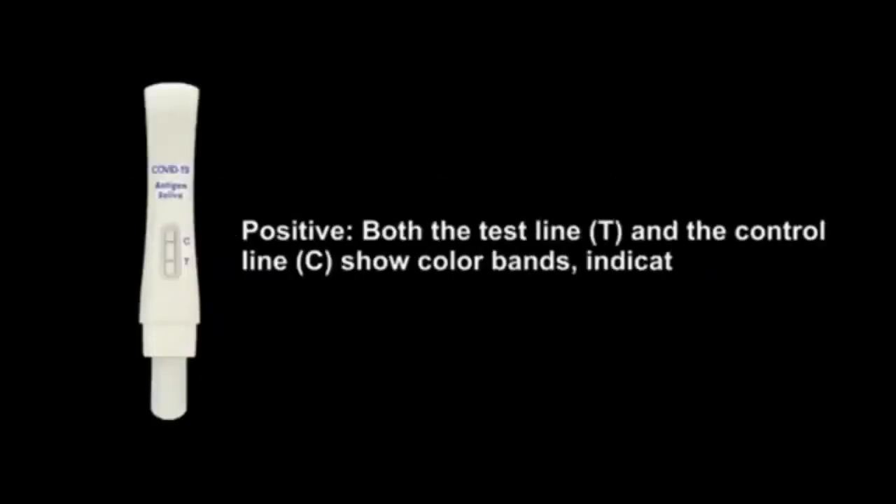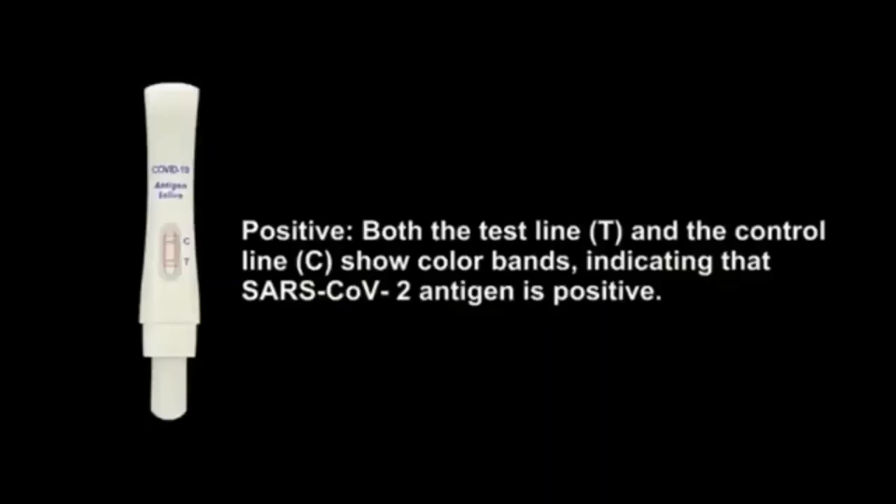Positive: Both the test line T and the control line C show color bands, indicating that SARS-CoV-2 Antigen is positive.